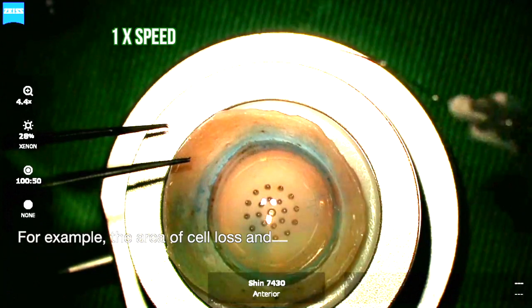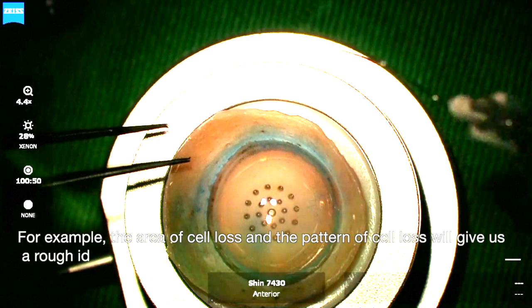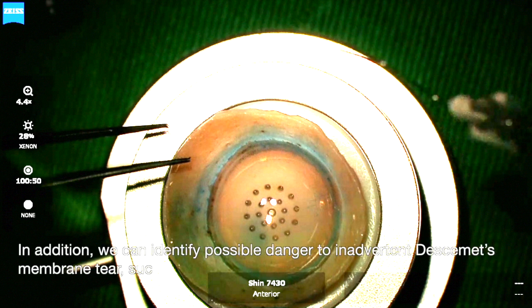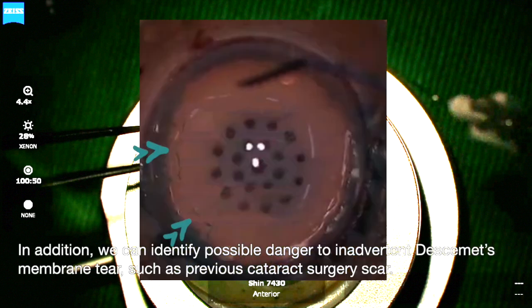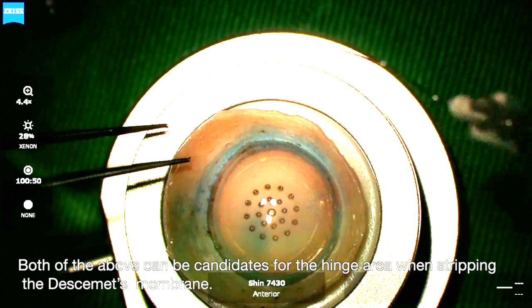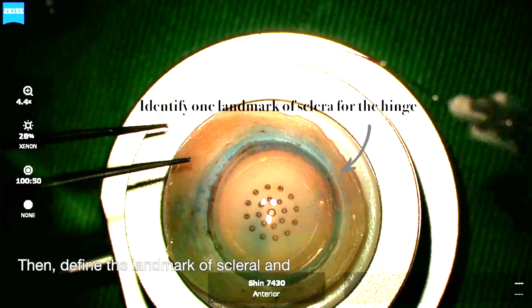For example, the area of cell loss and the pattern of cell loss will give us a rough idea of the quality of the cornea. In addition, we can identify possible dangers for inadvertent Descemet membrane tear, such as a previous cataract surgery scar. Both of the above can be candidates for the hinge area when stripping the Descemet membrane. Then define the landmark of sclera and Schwalbe's line.